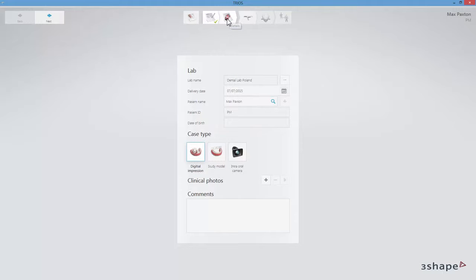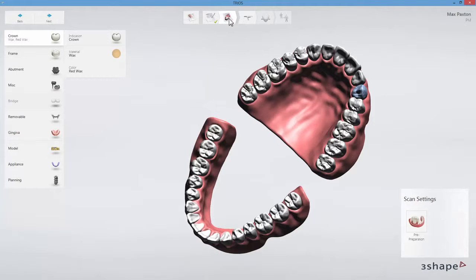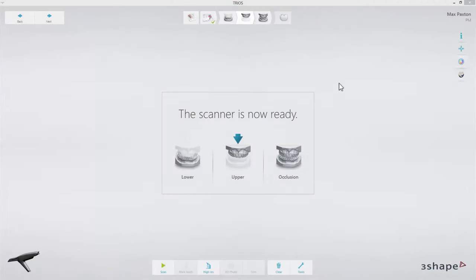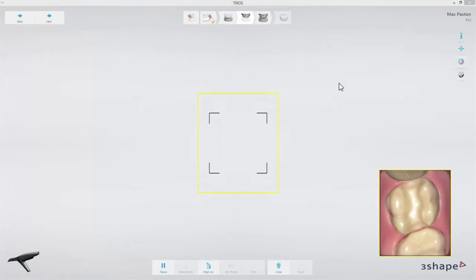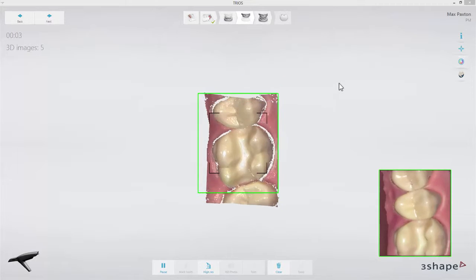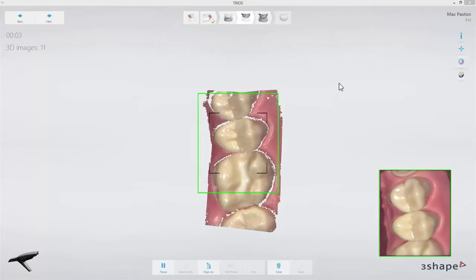At the beginning, create an order as usual. Choose the type of indication and go to the scan page. Do the scanning process as you normally do. In our example, we will focus on a quadrant.